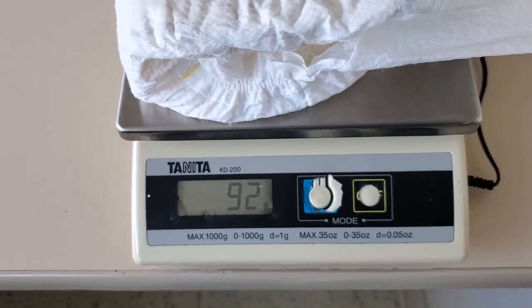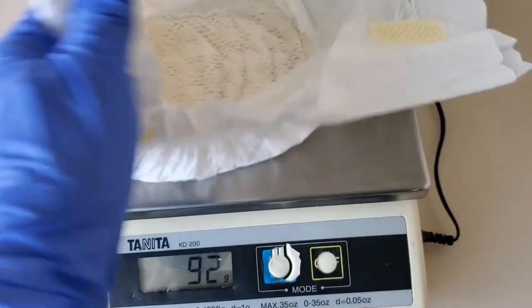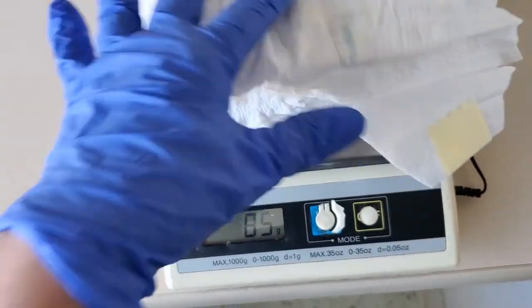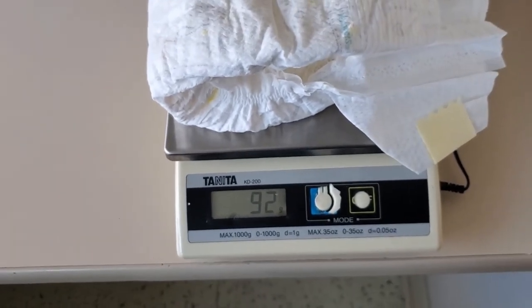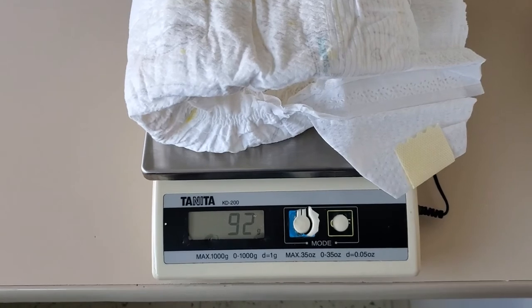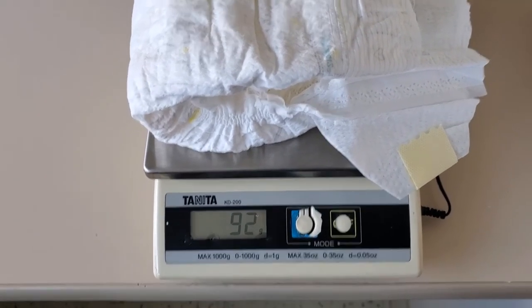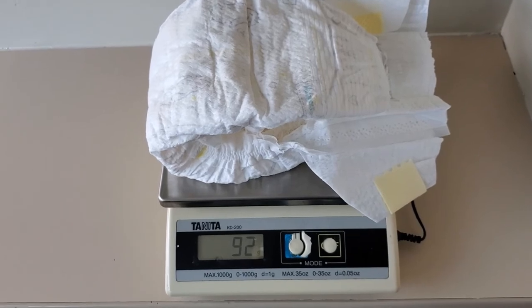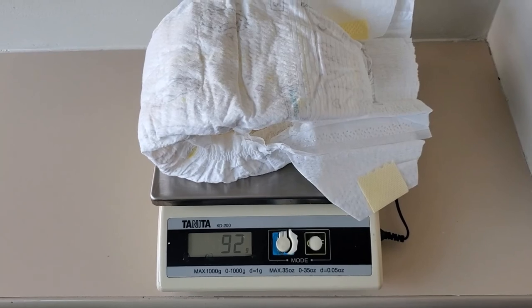It says mL's in the chart, but mL's is the same as grams in urine output. I don't have any pretend stool in here, but if there was stool, you would need to open it up and look at it, then place a one in the stool column in the chart. Add a comment if it was small, brown, mushy — or whatever you might see in children's diapers. These are diaper weights, and they're crucial to patients' overall improved outcomes.